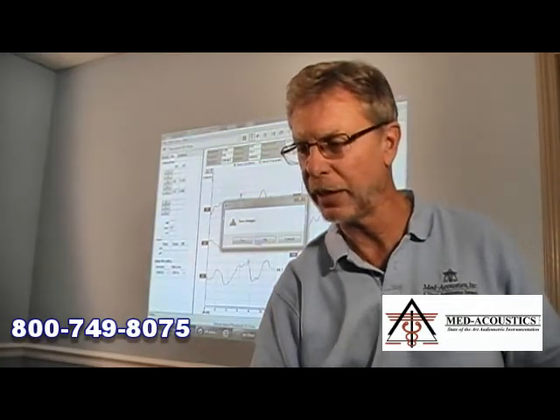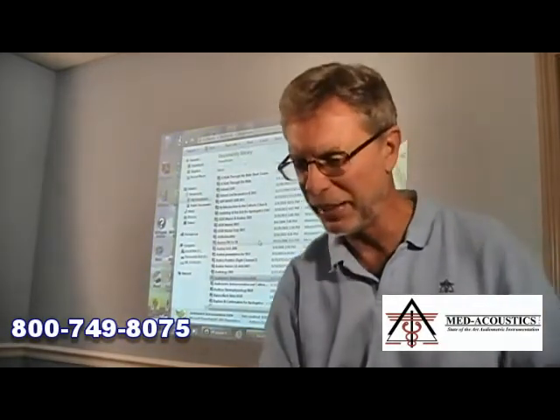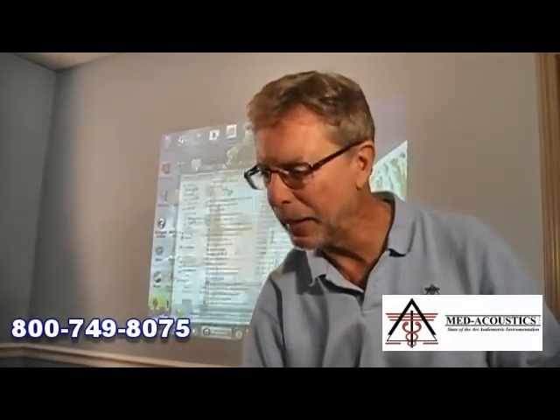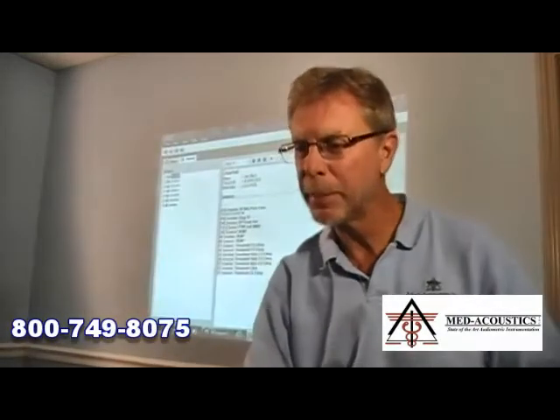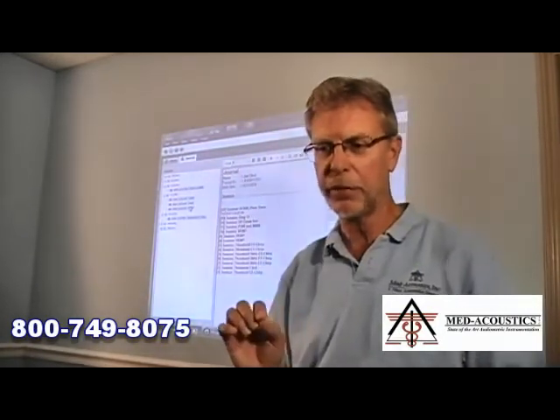I'm leaving the application of the ABR right now, and this is asking me if I want to save changes like the marks that I just made. And I'm going to say no, so I can show that to somebody else again sometime. And I'm going back to the database where I have Jan's case here, and I'll maybe want to show you some other work that we've done. How about some VEMPs? I just chose a VEMP that we did on her, vestibular evoked myogenic potential.